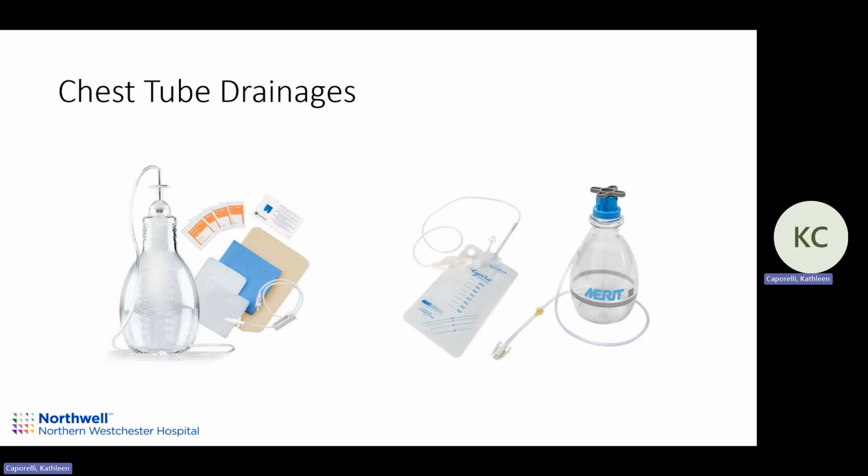It's usually a cap. You take the cap off, clean with alcohol, plug these in, twist, and then this drainage bottle. There's a little flat part there. You push that in, and that opens the suction. This bottle has negative pressure already set in it, and it just sucks the fluid out.